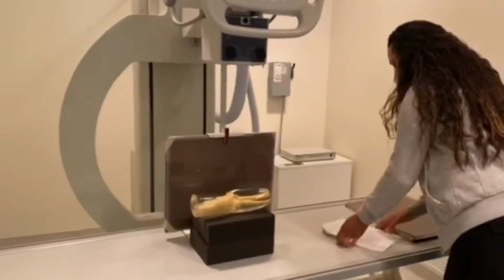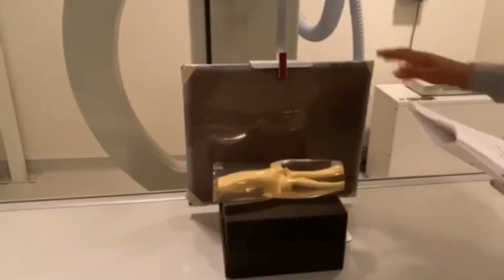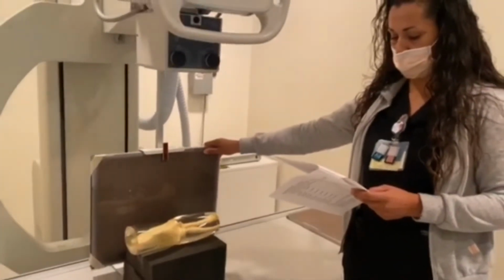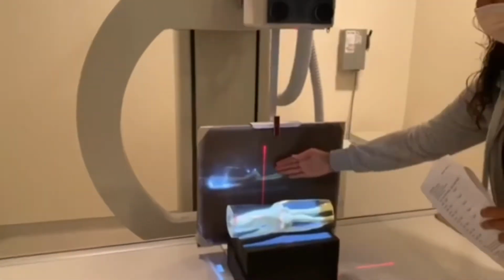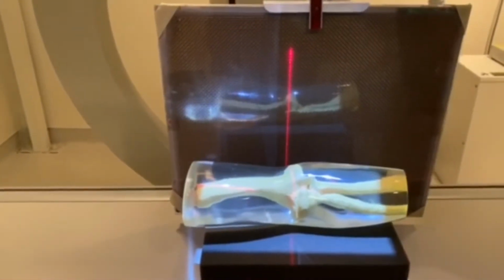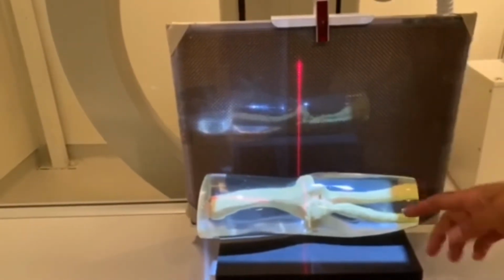After that, your instructions say, using the IR holder, place the IR with the wire mesh in the holder and place it 5 inches, using a ruler, from the phantom body part. So here's your IR, and then here's your part. Your part is going to have a 40-inch SID, and your part is what's going to be in the beam. So you have the beam here.